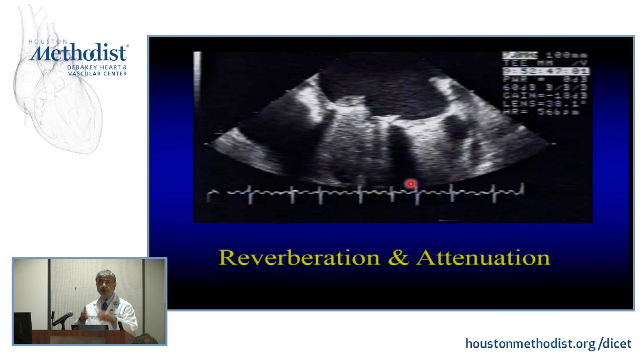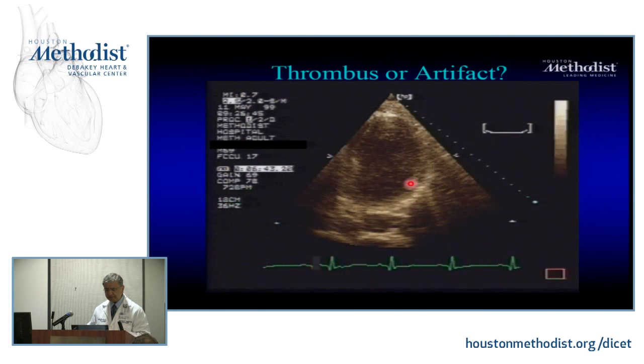This limitation is not present on a CT. It has other issues, right? This limitation, meaning attenuation, is not necessarily present in MRI. They have other issues. We have our own issues. But you need to know what each one of the modality has issues-wise, and that's why you're going to need that, okay? Now, we have other issues too.